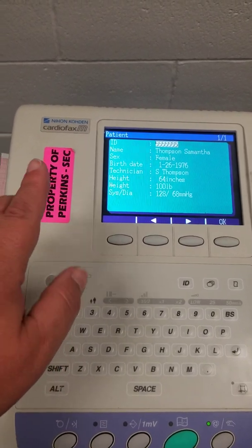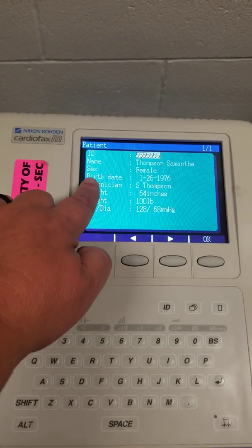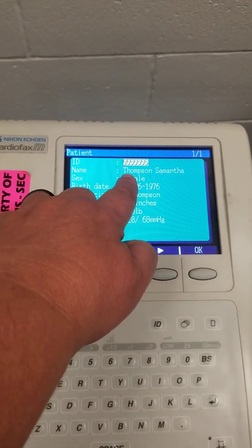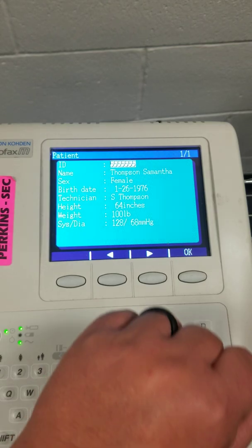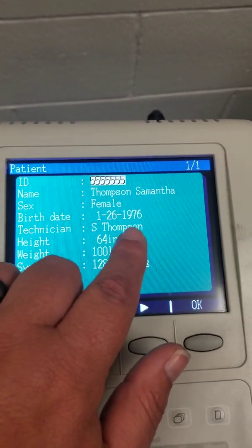When you put in all of the information, make sure that you have your patient's name: last name, first name. For your technician, please put first initial, last name.